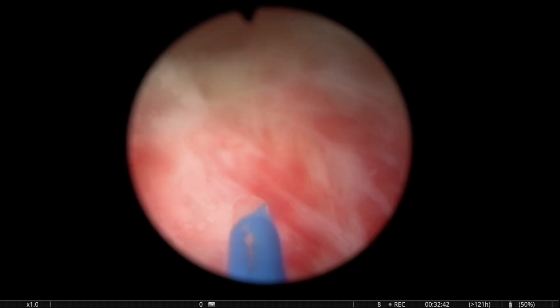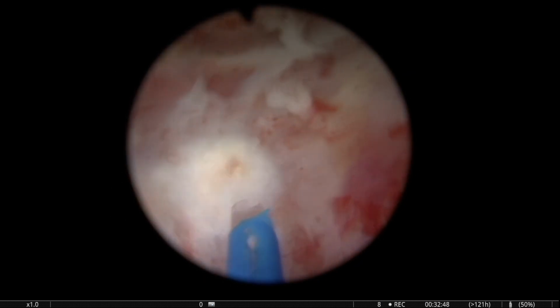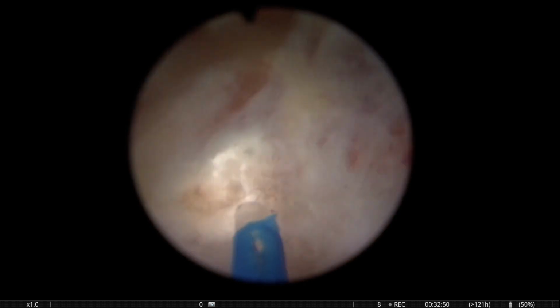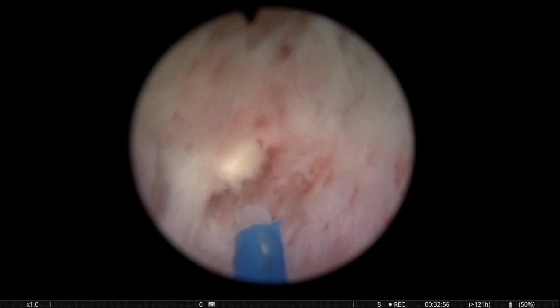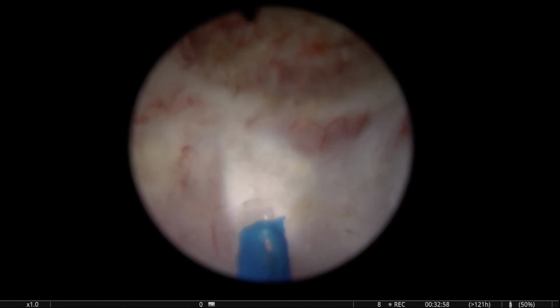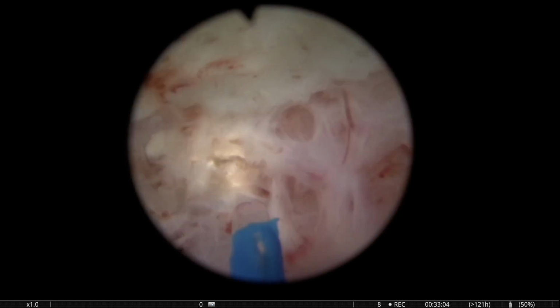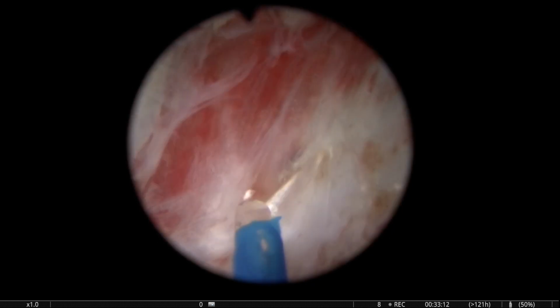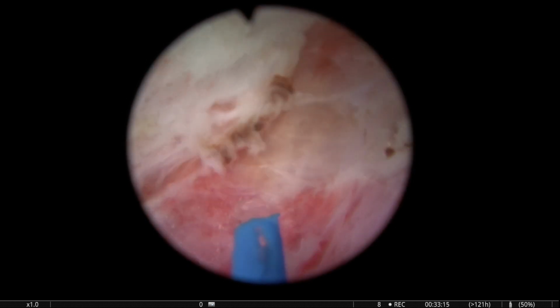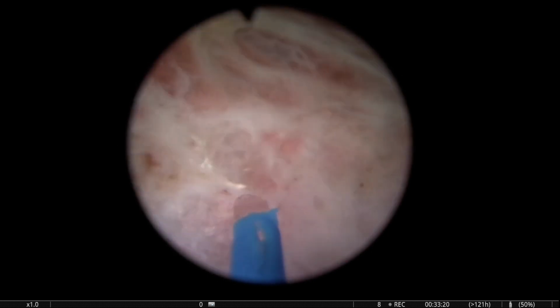So often, if you see a venous sinus, you can try to stop it by using the rolly ball and the resectoscope, or if you have a big electrode, sometimes this is helping a little bit more. And we have to try to master this procedure so that we don't go too deep, and we don't see these sinuses, because they make things a little bit more difficult, and especially morcellation, I would say. And also they put the patient at risk of absorbing liquid and having consequences from absorption.